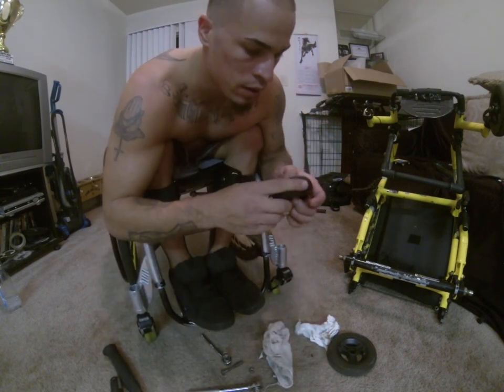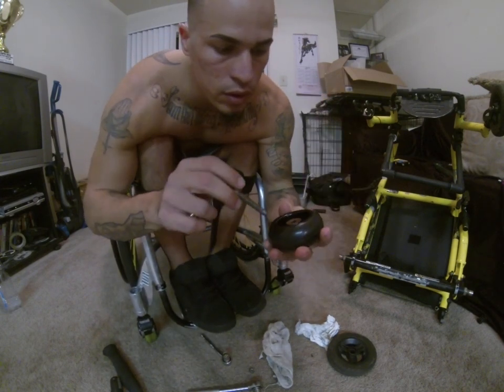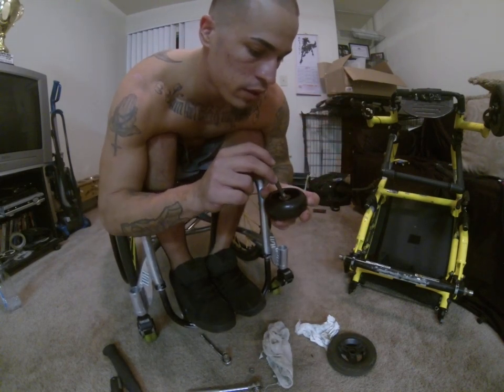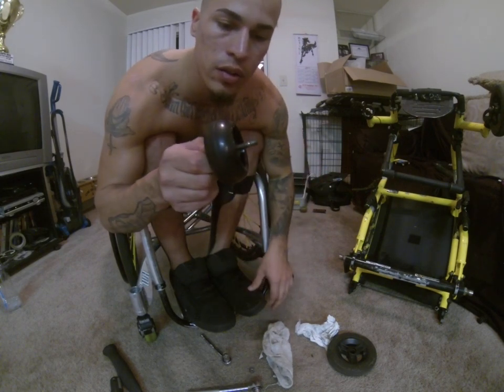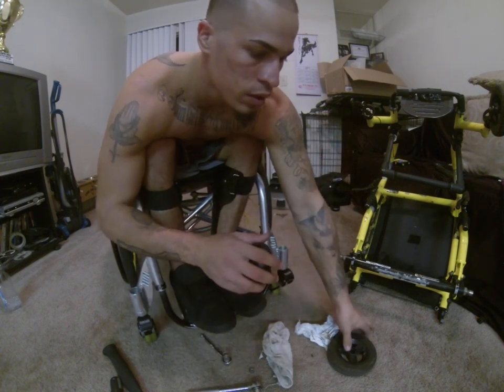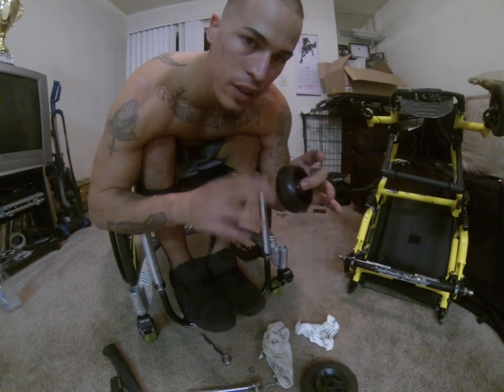Okay. Now that they're in there, you hear it? It's a little loose, so what you're gonna do when you're putting this back through the fork, you gotta find the right place to go through, and it should go right on there, and it should spin perfectly. Having a smaller wheel on there should reduce your caster flutter. So hopefully that works. You know, you can find a smaller one like this.